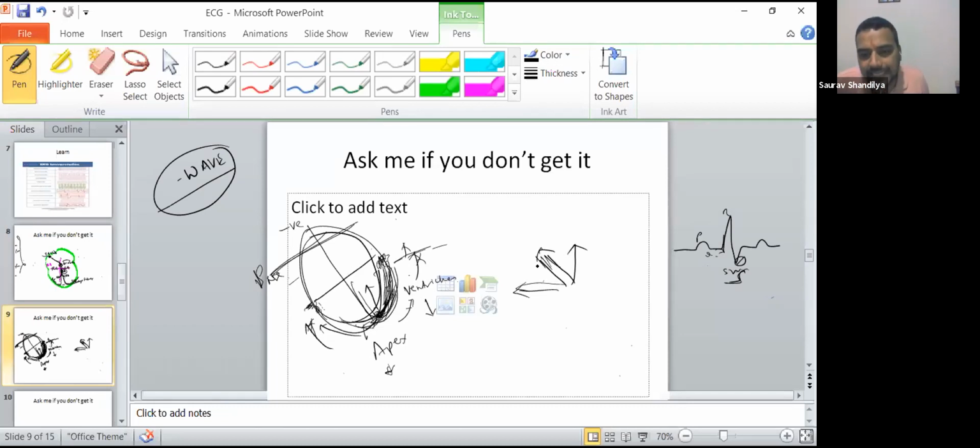So negative to positive, current is anyway flowing, but for the recording terminal, because the vector has gone opposite, the baseline, remember the isoelectric line, it will go below the baseline. Okay, so the S wave will be like this before it goes up. S wave. Is it okay? Understood this? I'll just check out the question. Please repeat. Okay, fine. Please explain.